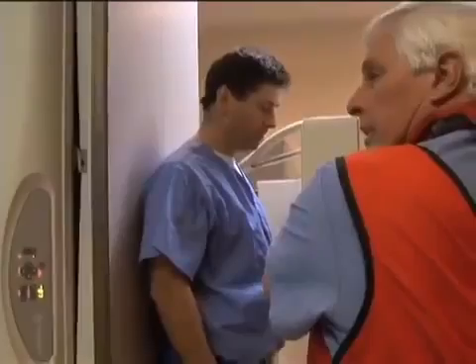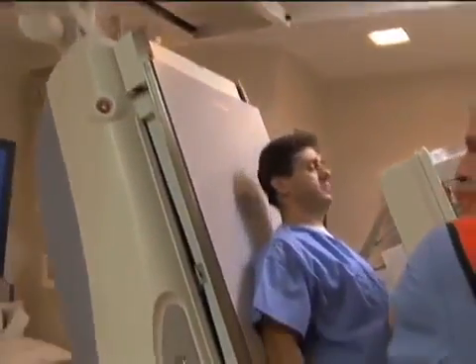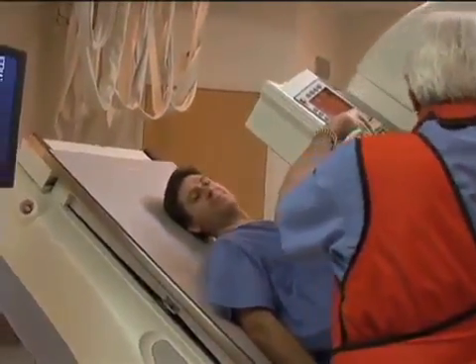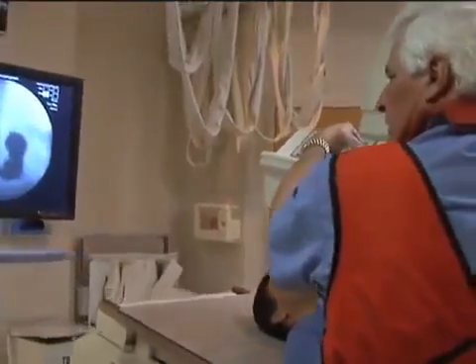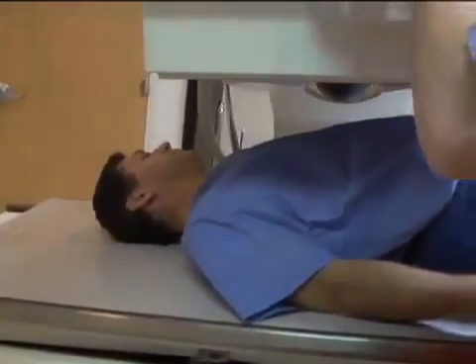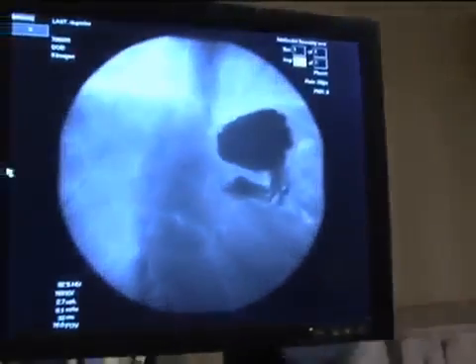All right. I'm now going to lay the table down — lean back, please. And as a final step, we're going to check for gastroesophageal reflux. We'll go into the horizontal position and in a slight amount of Trendelenburg. I'm going to have you turn to the left side, and I want you to bear down now — strain down, the Valsalva maneuver, which he's doing now — and there is no reflux, his stomach looks normal.